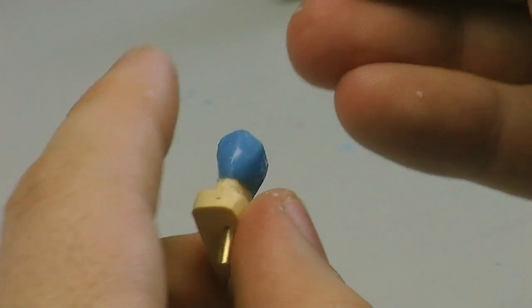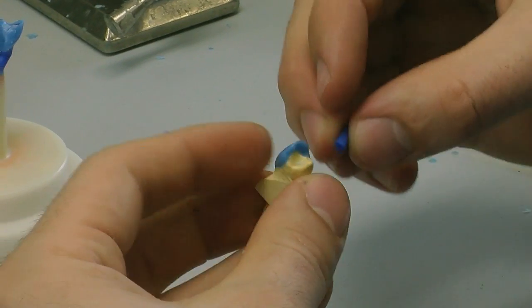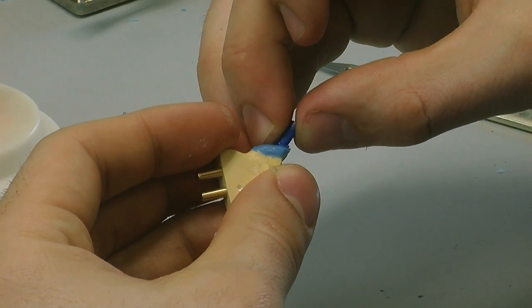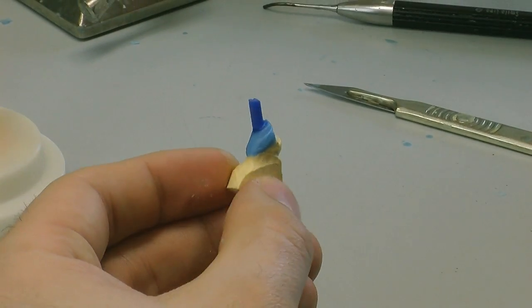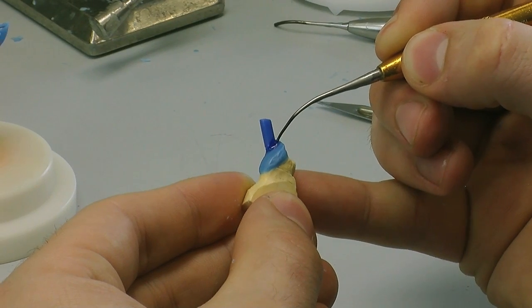So now we're going to do this with every die, and then they're going to be individually sprued, ready for pressing. Effectively what we're doing, these are channels that the Emax lithium disilicate is going to travel down. So it comes as a pellet form and it'll be pressed inside a furnace, so it turns the pellet into actually our finished substructures. So all we're doing now is melting the wax around the sprue onto the casting there.